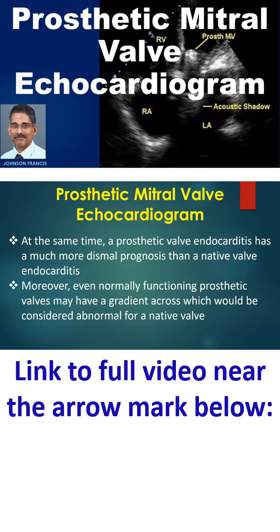At the same time, prosthetic valve endocarditis has a much more dismal prognosis than native valve endocarditis. Moreover, even normally functioning prosthetic valves may have a gradient across them, which would be considered abnormal for a native valve.